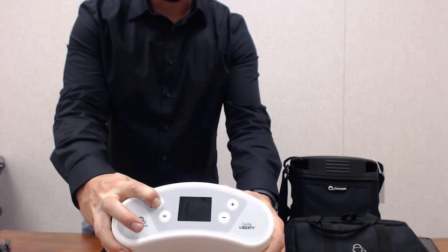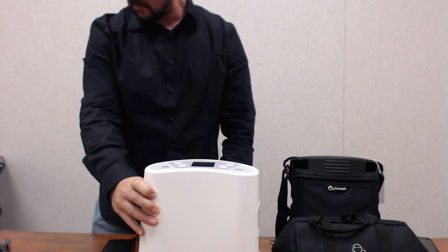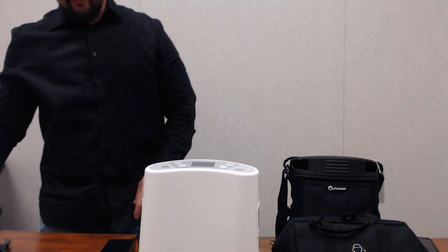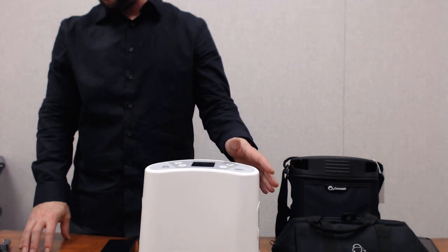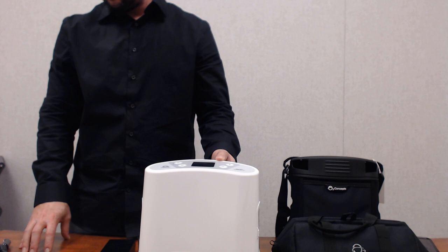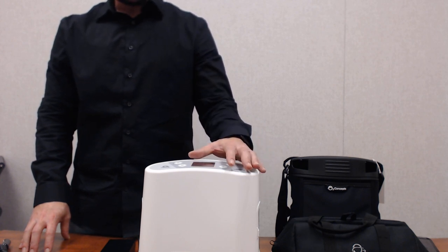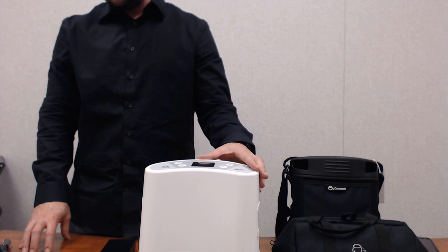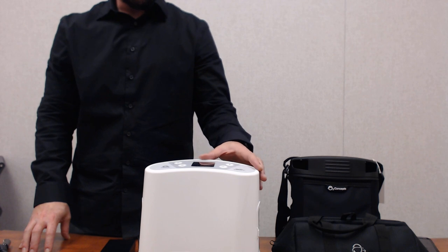To turn the unit off, just hold the power button back in until the device shuts down. On pulse dose at setting two, average operating time for the battery is four hours. On setting five continuous flow — the max setting of one and a half liters continuous — the battery will operate around one and a half hours.